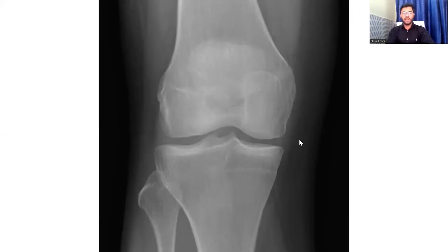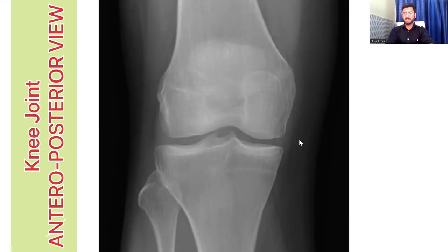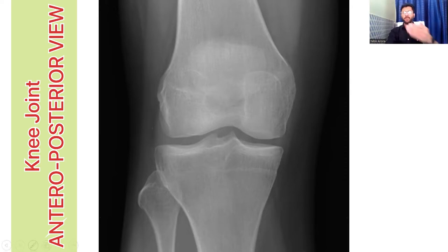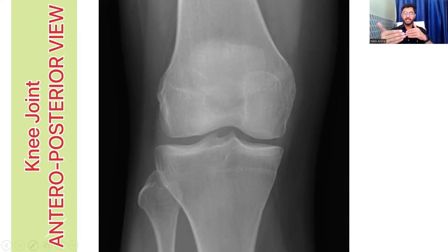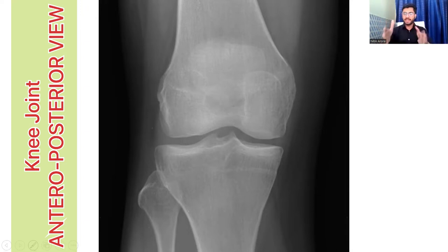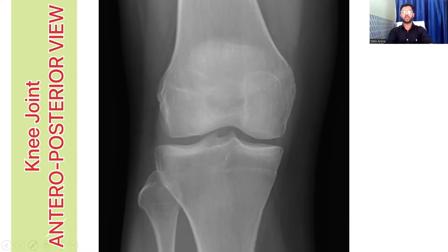The first x-ray we are going to talk about is this knee joint x-ray. It's an AP view of the knee joint — that is anteroposterior view. Whenever you get an x-ray, it will either be an AP view (anteroposterior), lateral view from the side, or skyline view from the top. There are multiple views, which we will be discussing in the next part of this video.